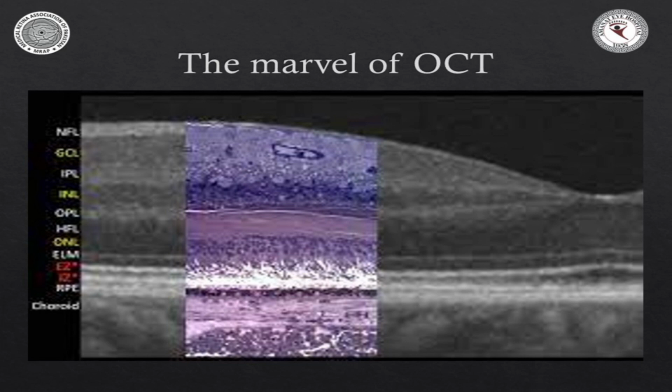So not only is this a marvel of biomechanical engineering, but also it has revolutionized our understanding of the retina. So from maybe, would be, could be, I think it is, we've gone to subjective evaluation, we've gone to objective evaluation of the retina, and we are now rethinking our disease processes and rethinking our guidelines for treatment. So that's amazing.